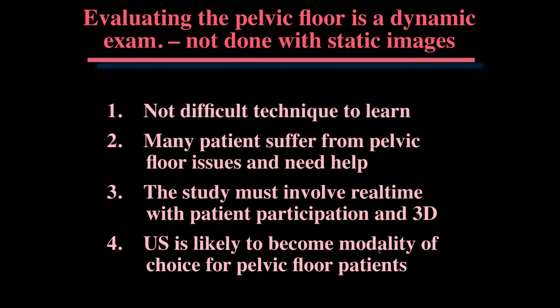So we've been at it here 45 minutes, and so I want to leave some time for questions. I really feel that evaluating the pelvic floor is not that difficult. It's got to be a dynamic exam. It can't be done with static images. You have to be working with the patient, ask the patient to Valsalva, see what happens. You can do a little clip so that you can archive it. Many patients really suffer from these pelvic floor issues that are very embarrassing when they leak or have these difficulties. And you can really help those patients who have these problems.